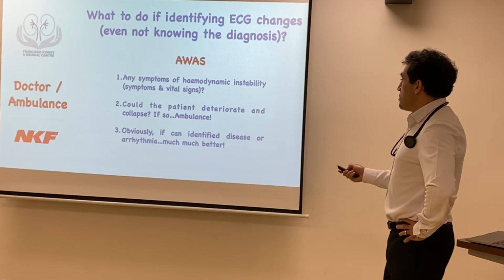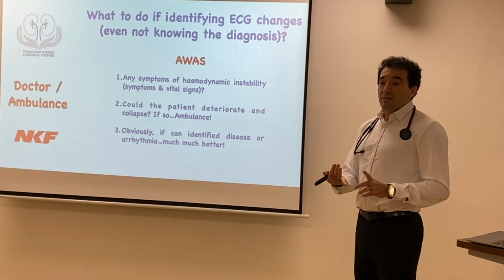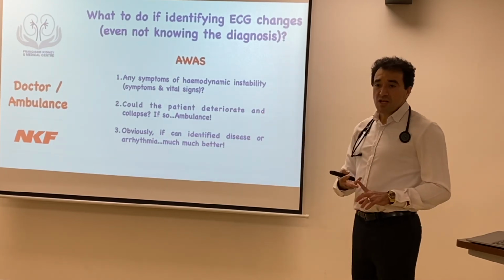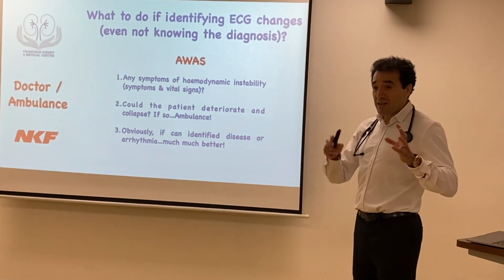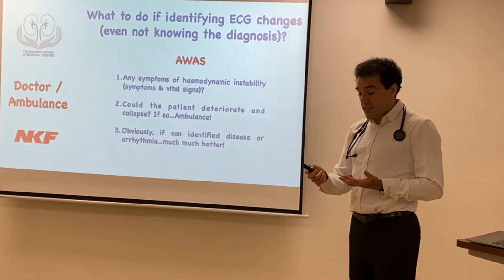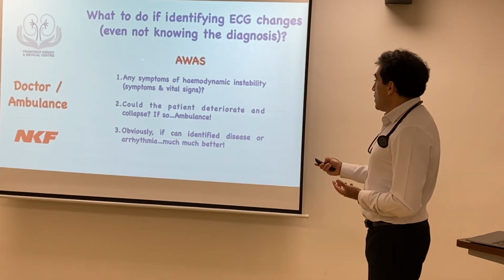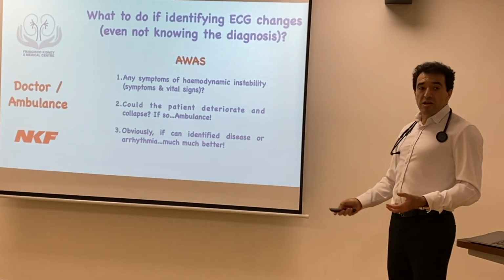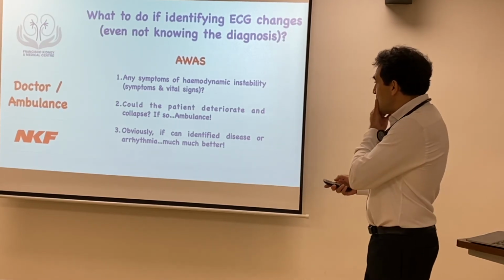And then obviously symptoms that the patient can have. Typically you can have many symptoms, but typically the patient feels dizzy, the patient can have some chest pain, or feel short of breath, no? Or presyncope or collapse or things like that. When the patient starts feeling like that, then you need to flag, and you should probably do an ECG, yeah? But once you do the ECG and you see some changes, it's important to know, is the patient hemodynamically stable? You need to take the vitals, no? And then see how's the blood pressure, is the patient oxygenating well, is there bradycardia, tachycardia, etc.